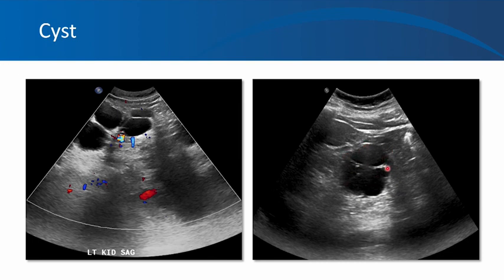So here you see septations, fibrous septations, which are white here and well-defined. And here you can also see some calcifications. Why do you call them calcifications? Because like stones, any calcified structure can give shadowing. Here you see enhancement, that is whitish structure posterior to the cyst. But again, here you are seeing shadow from this calcified structure. So here is a complex cyst with septations and calcifications.